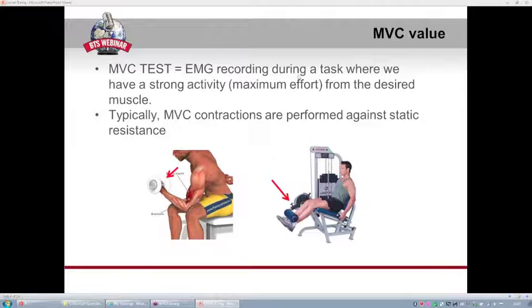The maximum voluntary contraction test has to be performed for each analyzed muscle separately. To perform this kind of test, some exercises can be arranged using belts in combination with manual resistance, for example, and also standard training machines can be very helpful to do that. You can use a repetition of maximum voluntary contractions, which last for a few seconds, then relax and then start again and so on, or you can use a single longer voluntary contraction.